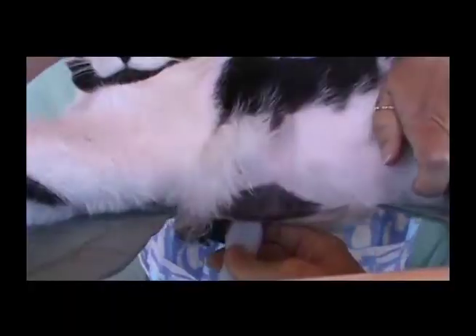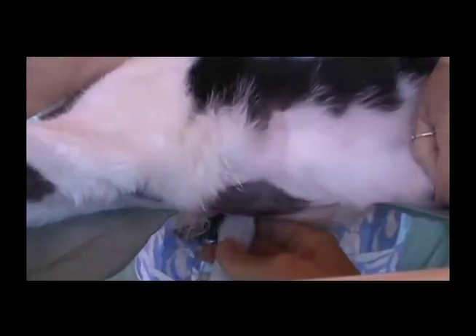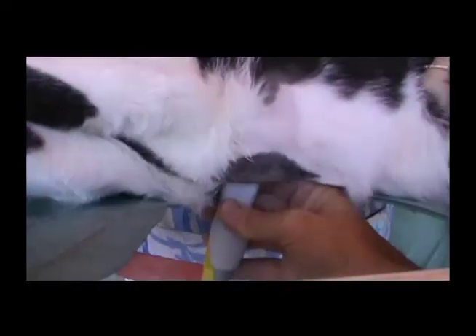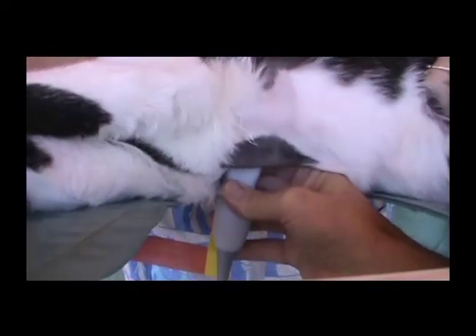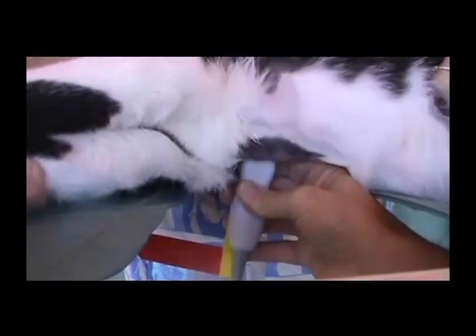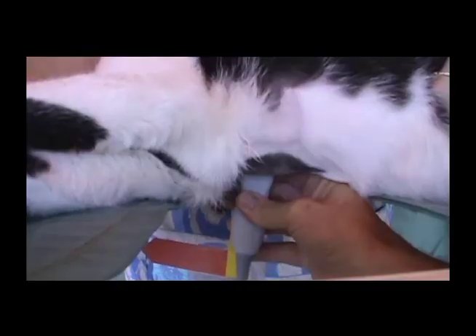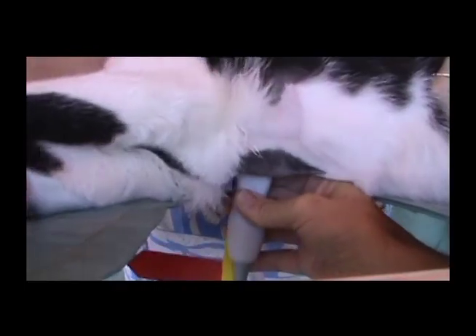ECG leads are often not used in patients that are not sedated. Recently, sonographers are experimenting with the adhesive ECG attachments used in human medicine and placing them on the patient's foot pads. Alligator clips are then attached to the adhesive attachment.